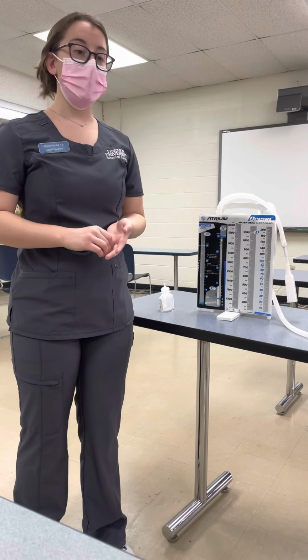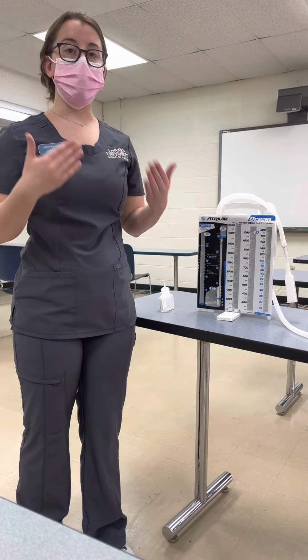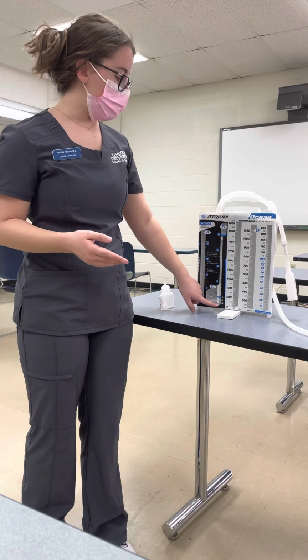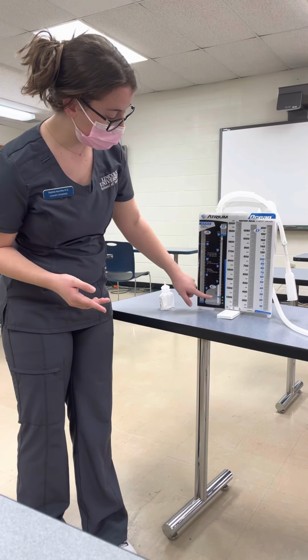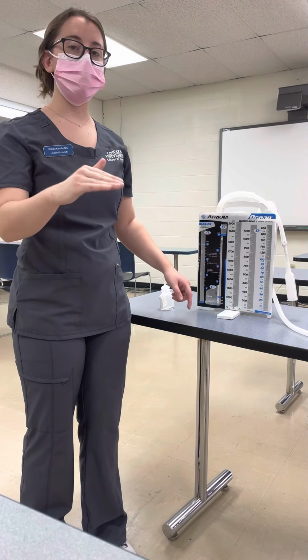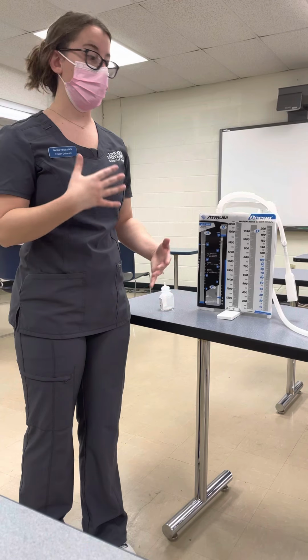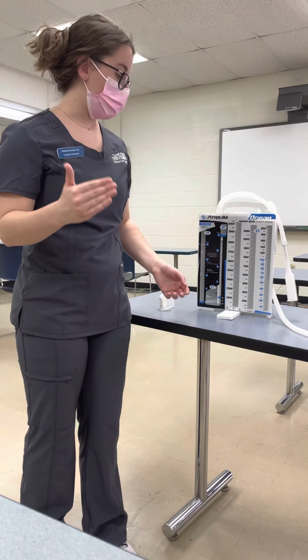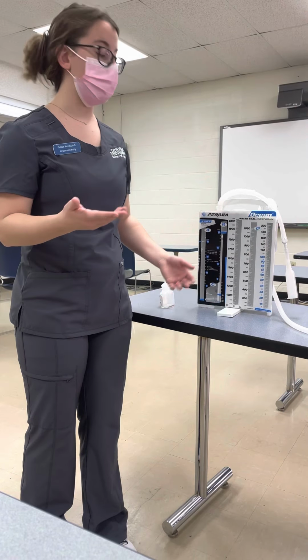We want to see that just based on their normal respiratory rate and pattern of breathing. So when we see this little ball come up here to the 2 centimeter mark when we fill it with water, we'll see that it rises and falls slightly depending on their breathing. If they're a deep breather, then it might rise and fall a little bit more dramatically than somebody that shallow breathes, but we still want to see that.